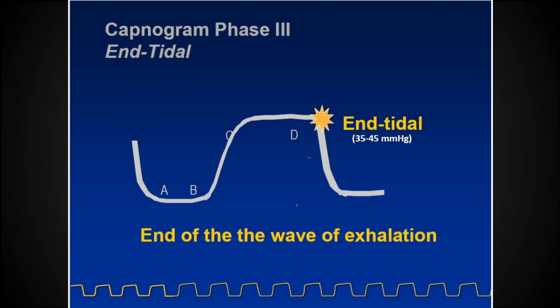On the question I just have an arbitrary 1, 2, 3, 4 or something, and I'm like, hey, where is end tidal measured? Just because I noticed that students often invert this in their head, where they view this like inhalation, and then the exhalation is shorter, when it's actually the reverse.